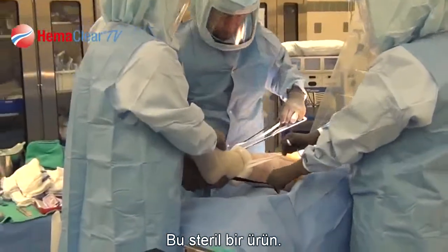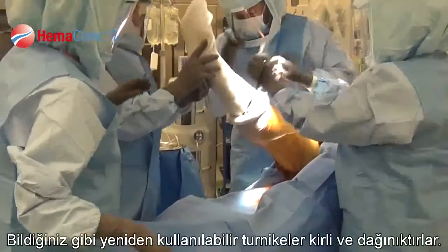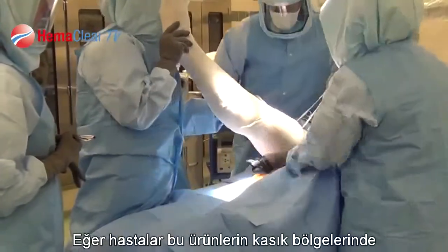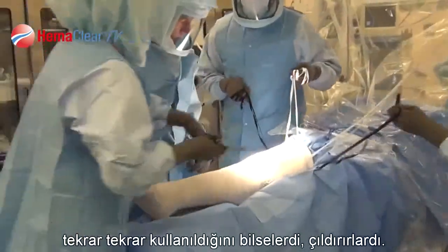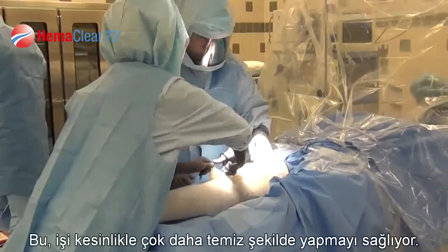It is a sterile device. Reusable tourniquets tend to get very dirty and messy, and I think if patients had any idea that we were applying those things over and over again to their groin area, they'd be appalled. So it certainly is a much cleaner way of doing things.